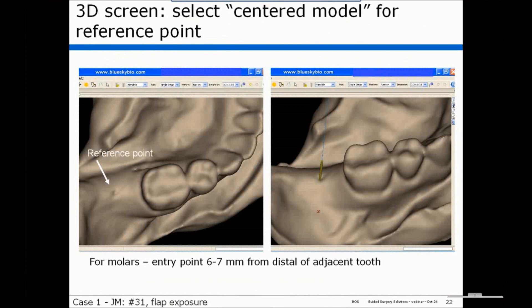We then go back to the 3D screen and select the centered model. The centered model is a 3D image of a model with a reference point in the ideal location for this implant. For a second molar implant, the entry point would be 6 to 7 millimeters from the distal of the adjacent tooth. We can then see where the center line of the implant is relative to this ideal position. This helps overcome the problem of looking at 3D in 2D, because the ideal position is based on a physical model you can see in hand.